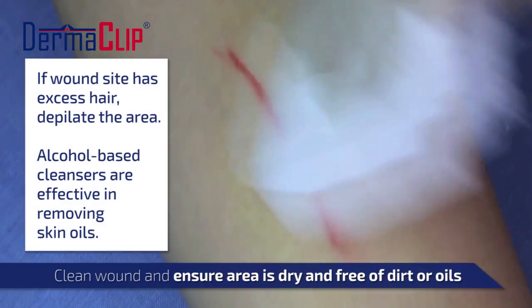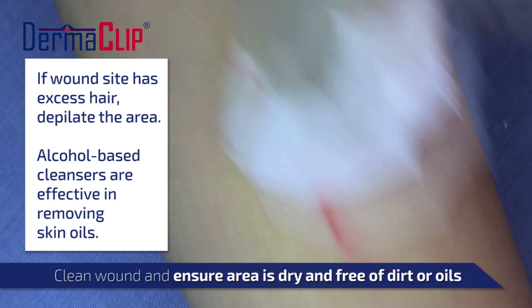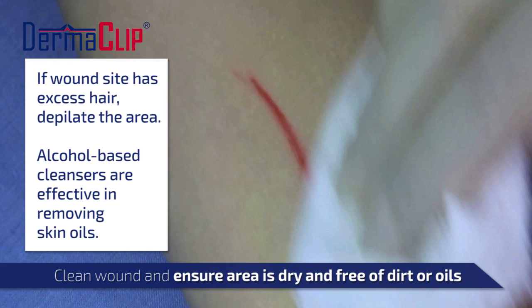Before applying the device, clean the wound area of all dirt and oils, remove all excess hair, and dry the area to ensure a good bond with the skin.